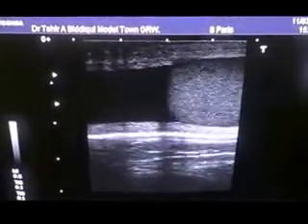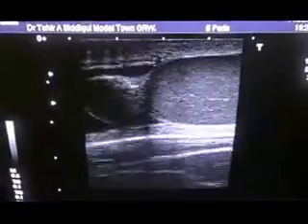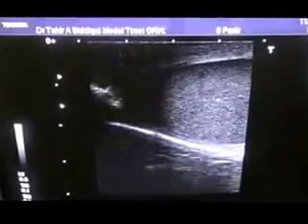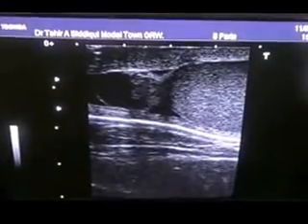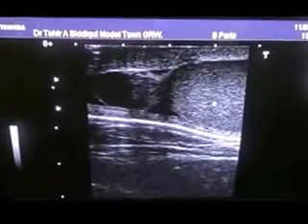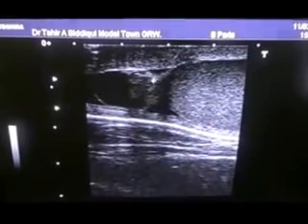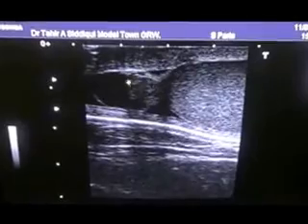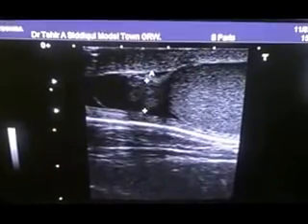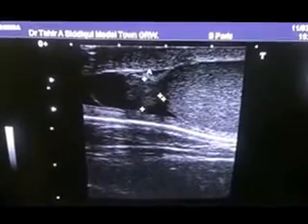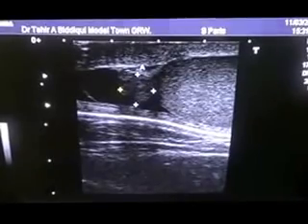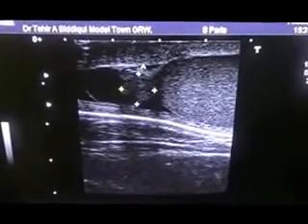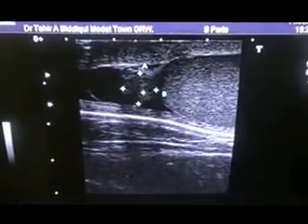Now this is the cystic area. This is the medial border of the right testis, and this area that you are seeing is the epididymis — this echogenic area from here to here. In this scanning plane, this is not the total epididymis, but this 7.1 by 7.4 mm low-level echogenic solid area in front of you is in fact the epididymis.